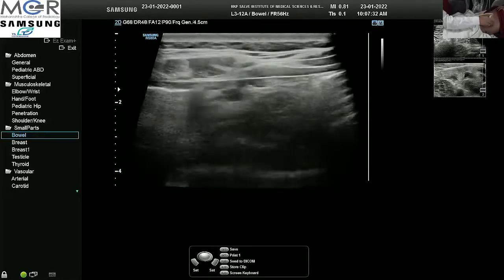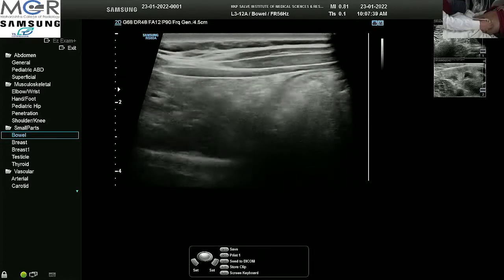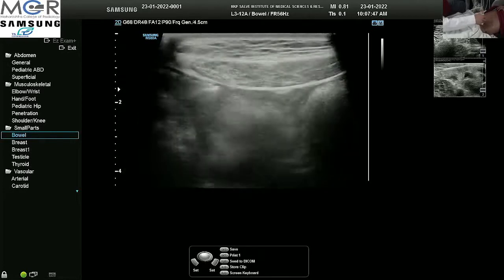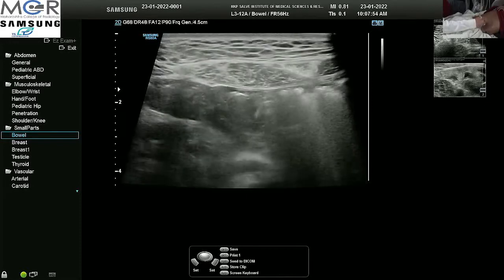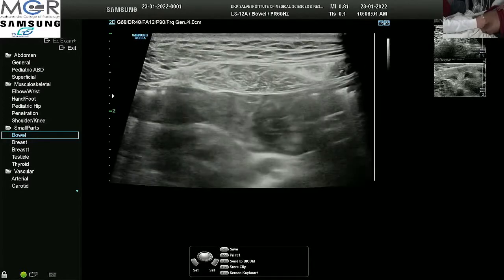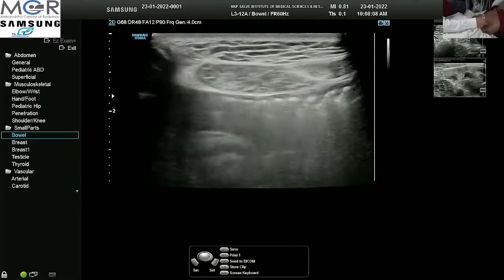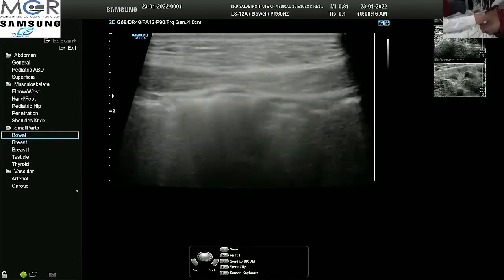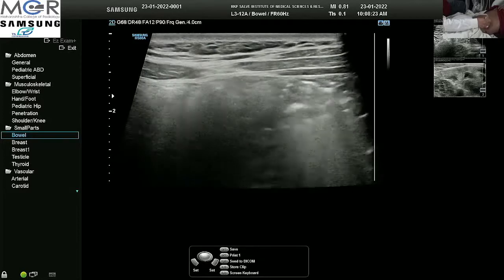I am once again trying to see the valvulae conniventes to check if the fluid has reached there. This is a jejunal loop showing some fluid, the valvulae conniventes, and gas within.